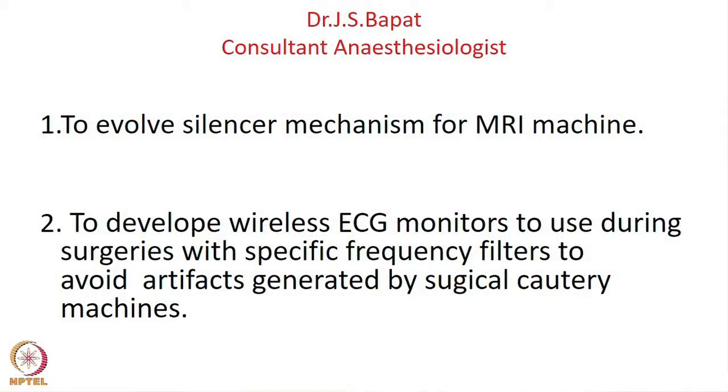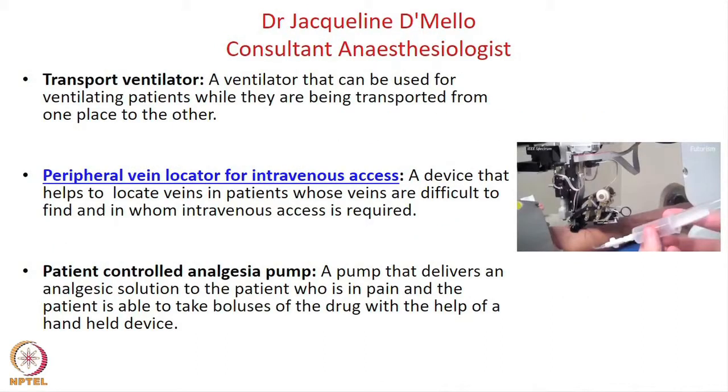How does it help? Can we have wireless ECG monitors? In movies you would have seen ECG monitors, multiple wires to your chest, hand and legs. Why can't in today's day and age we have wireless monitors? This becomes very important because in surgery, doctors use cautery. The frequency of a cautery mixes with the frequency of the leads, causes artifacts. Okay, so that was one of his wishes.